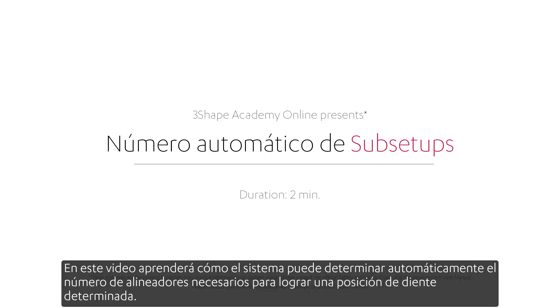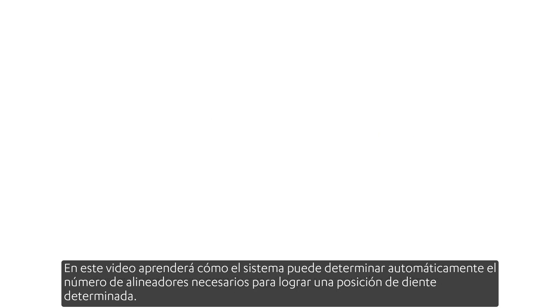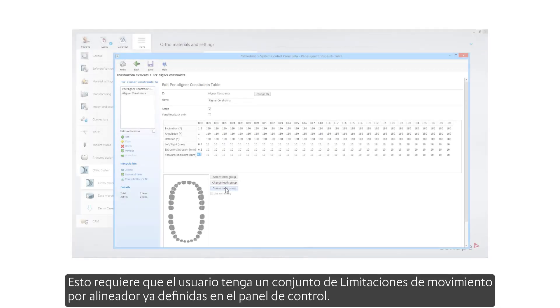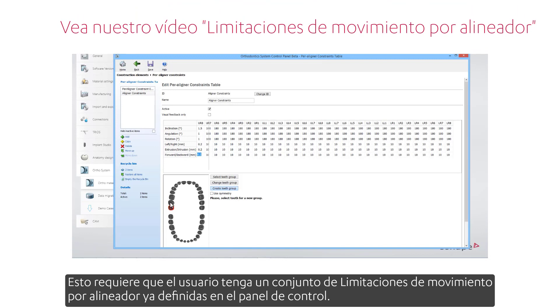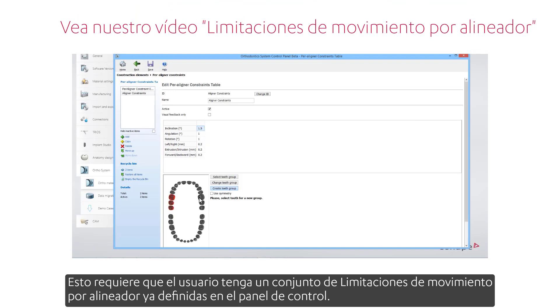In this video you will learn how the system can determine the number of aligners needed to achieve a given tooth position. This requires the user to have a set of per-aligner movement constraints already defined in the control panel.